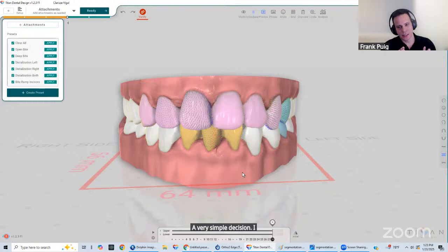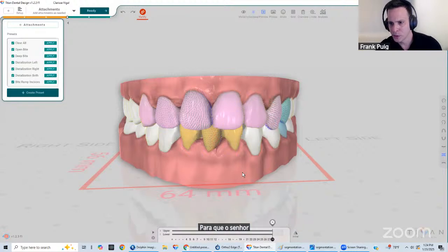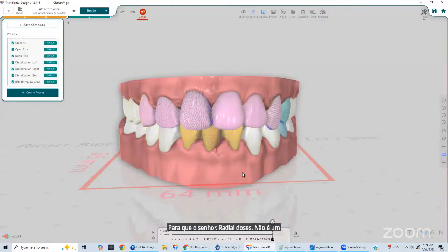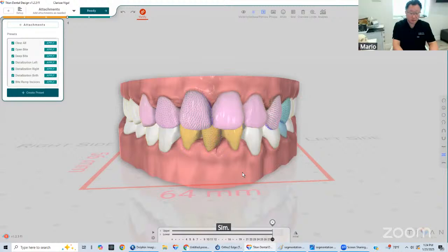I cannot give an exact estimate because, yeah, there's the problem with 2D projection is the geometry, and it's very difficult. Again, we will make the same mistake as we have been doing for years. So the fact that radiation dose is not a concern anymore. Sorry, did I lose the audio? Radiation dose is not a problem. Can you hear me? I can hear you, yes. Oh, I lost the audio. Just a second.